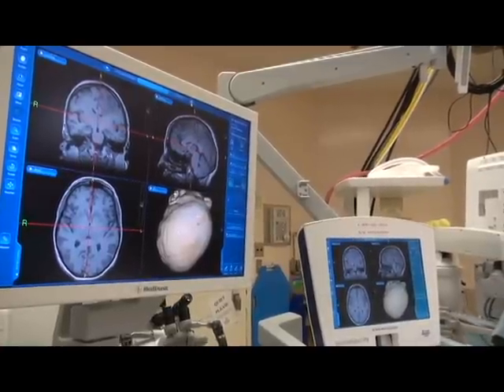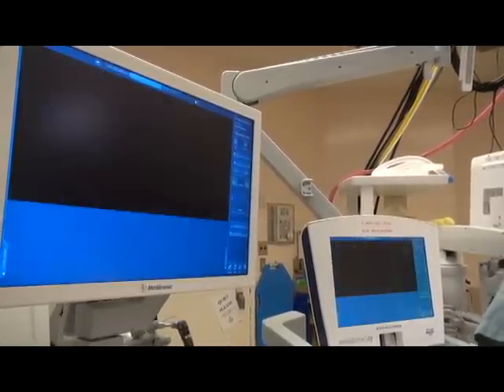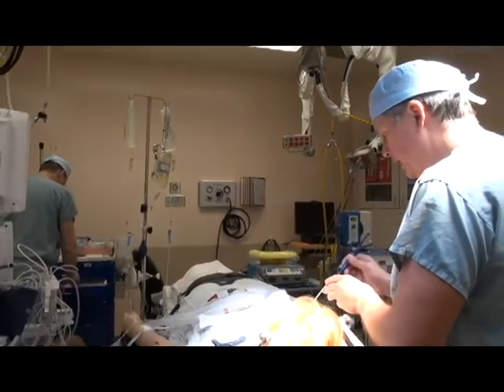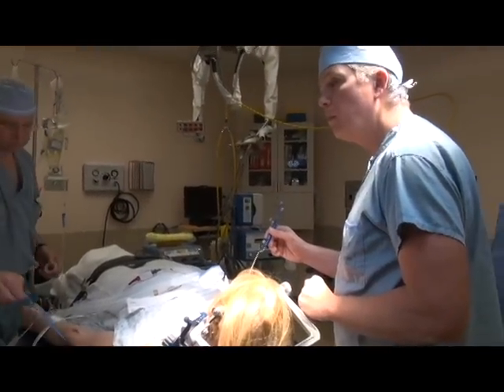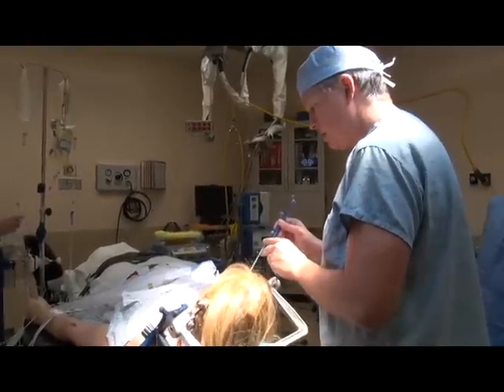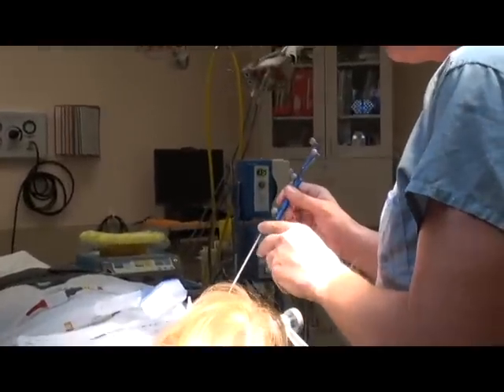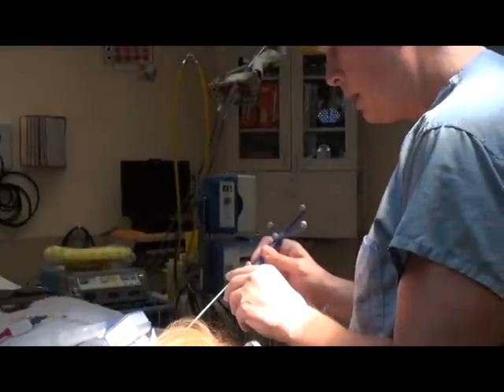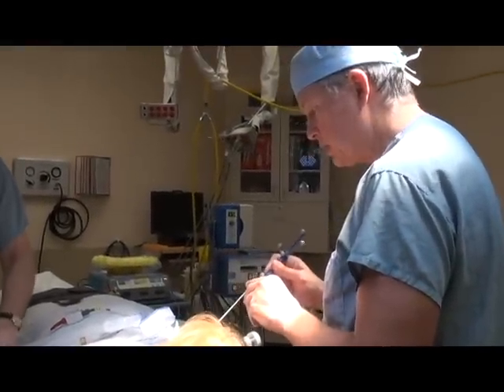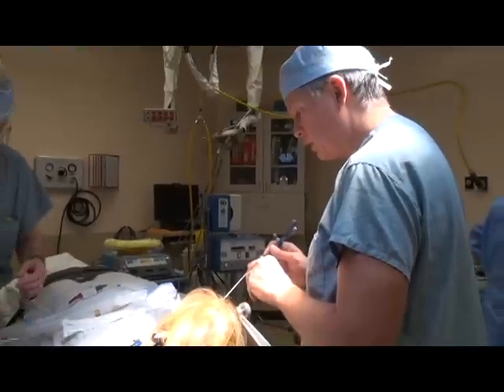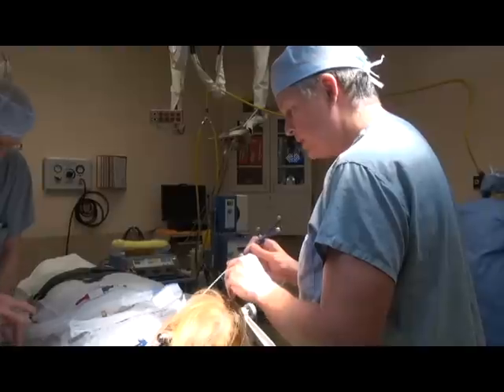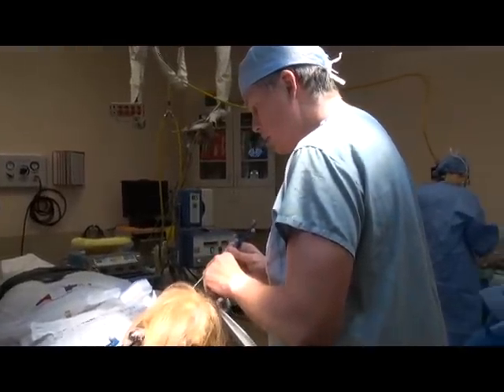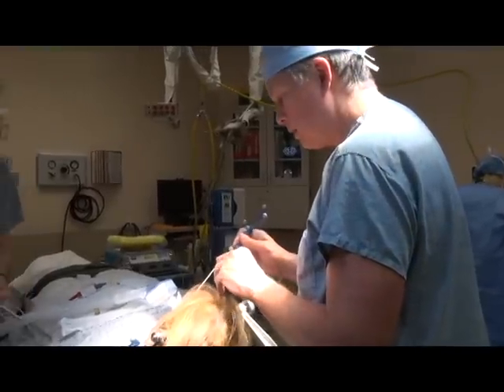We're going to register superficial markings on her so we know exactly what we're looking at. We mark the tip of the nose, the forehead, and then over the left eyebrow. Then we trace patterns over the skull so that the computer program can recognize surface markings and correlate that with what's going on inside the head. When we track where we're going, we'll be able to tell exactly based on the topography of the nose, forehead, and head.